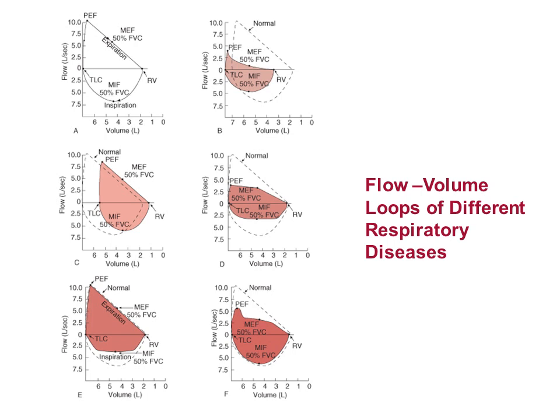While if we try to do expiration, on the contrary, the wind of the air will push the vocal cord up and open the way further, so there will be no obstruction during expiration. So the cut in the curve will be in the inspiratory part.